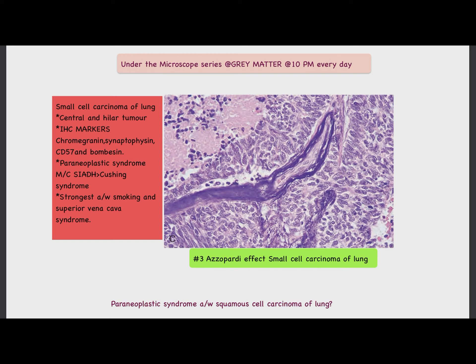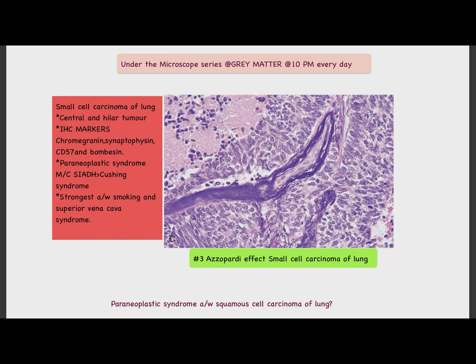The basophilic staining of the vascular wall is due to leaked out delicate nuclear material from the necrotic tumor cells. Since small cell carcinoma of the lung is an aggressive tumor, necrosis of the tumor cells causes leaking out of nuclear material, which stains the vessel walls bluish or basophilic.